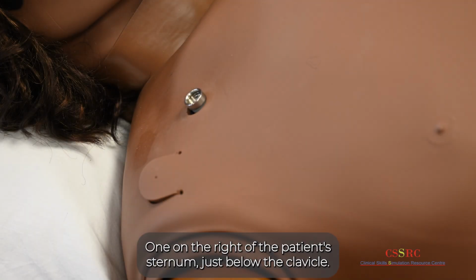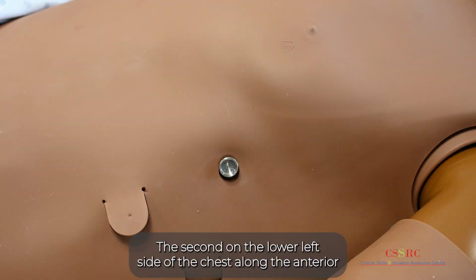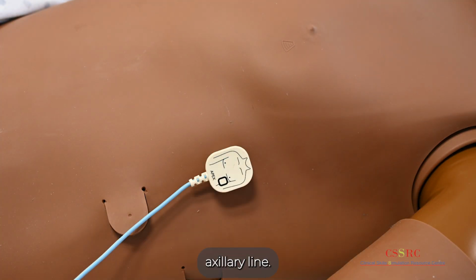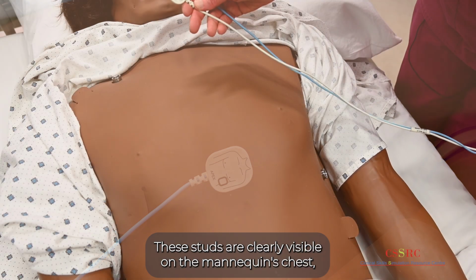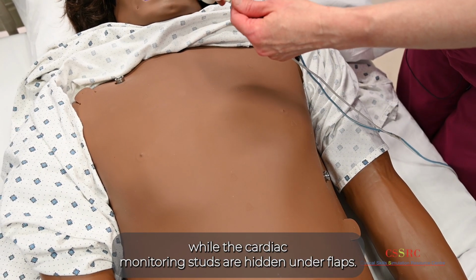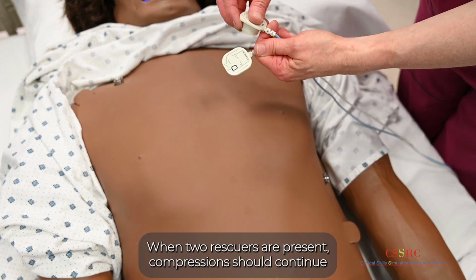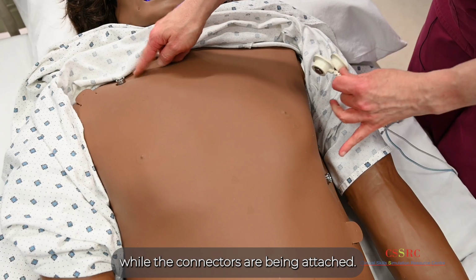One on the right of the patient's sternum, just below the clavicle. The second on the lower left side of the chest along the anterior axillary line. These studs are clearly visible on the mannequin's chest, while the cardiac monitoring studs are hidden under flaps. When 2 rescuers are present, compressions should continue while the connectors are being attached.